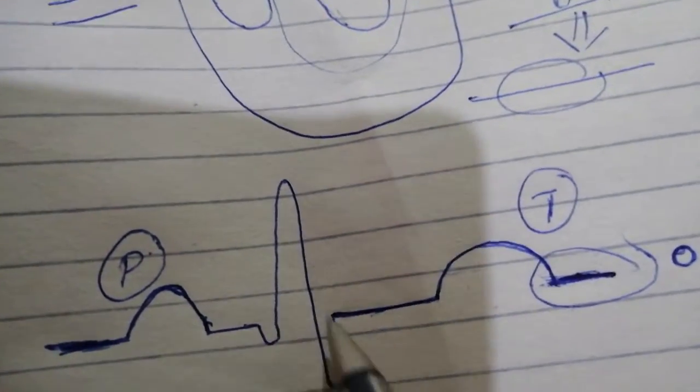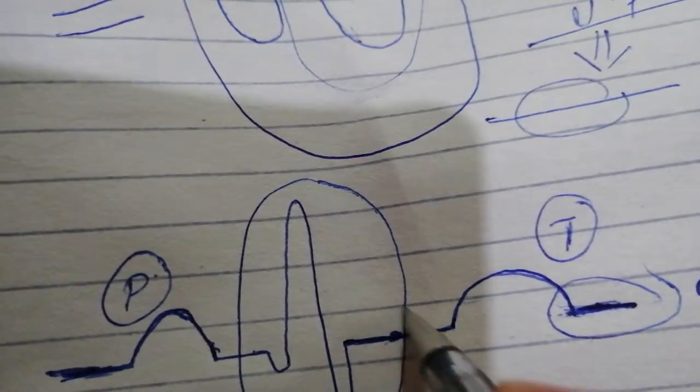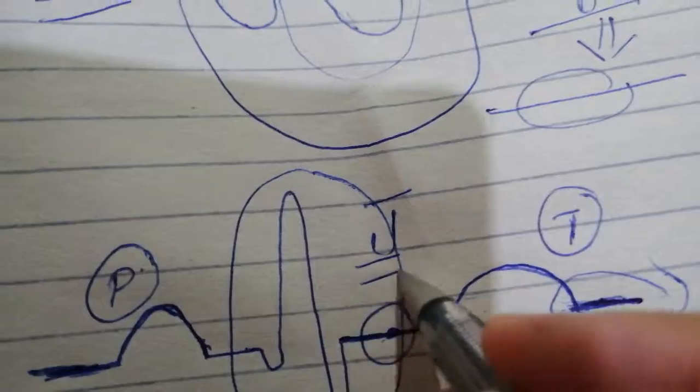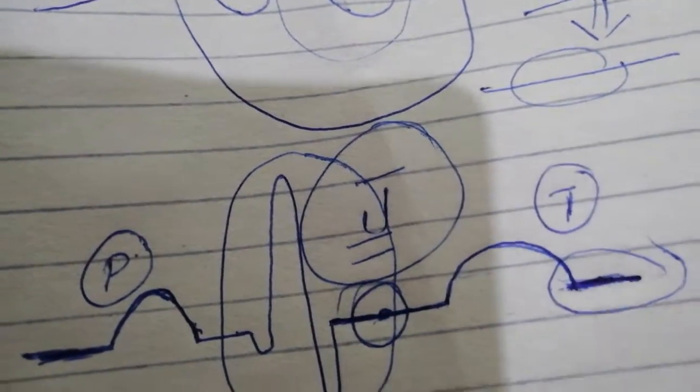So that point right after the QRS interval, you mark as J, and you know that this is where we are at zero baseline, and then you compare this segment with this one to figure out where this is happening. Now how do you know where the infarct is?